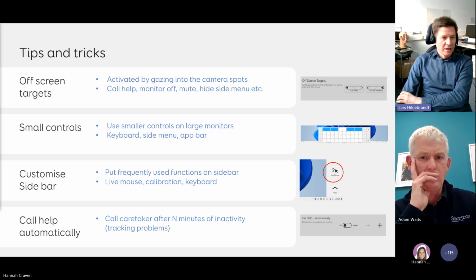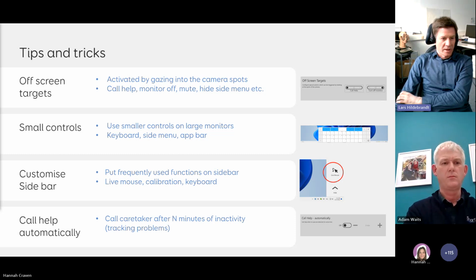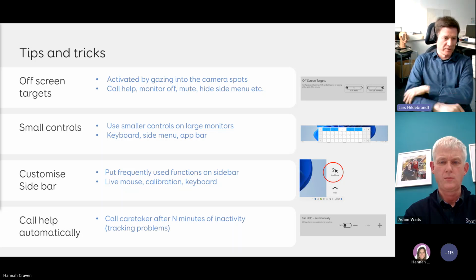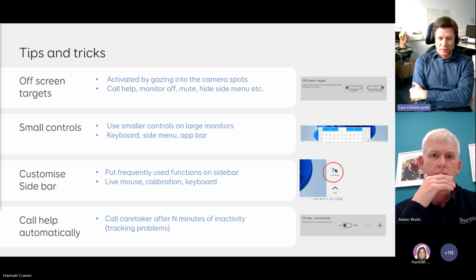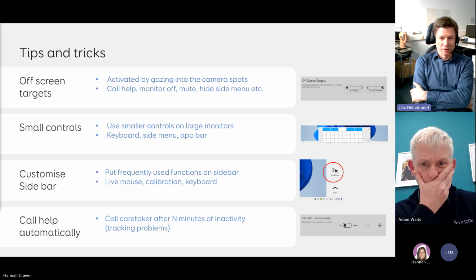Yeah, okay. Some more tips and tricks, off-screen targets. You can put special functions on the camera. If you look in the spots, then you can trigger some commands. You can customize the bar, call help automatically. What's on the next slide? Let's have a look.